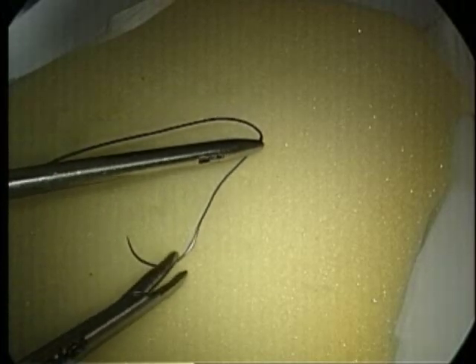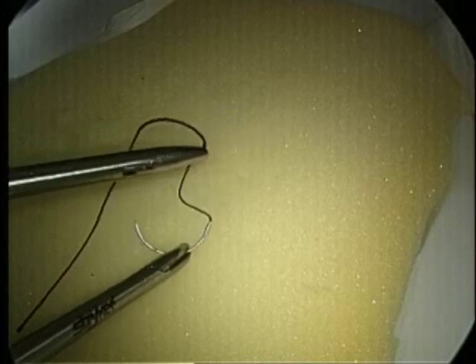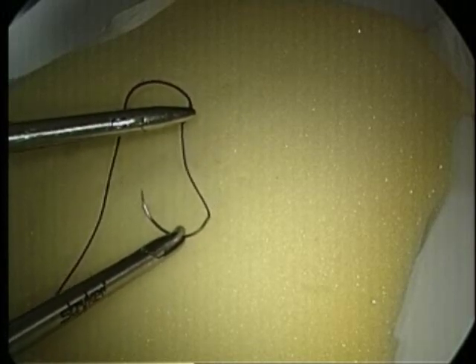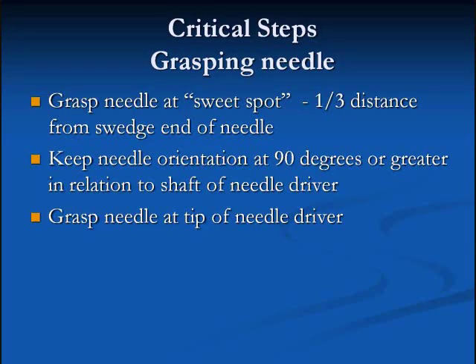The next step is grasping of the needle. In this step, the dominant hand — in this case the right hand — grasps the needle one-third of the distance from the swedge to the tip. Grasping too close to the tip prevents adequate tissue penetration.